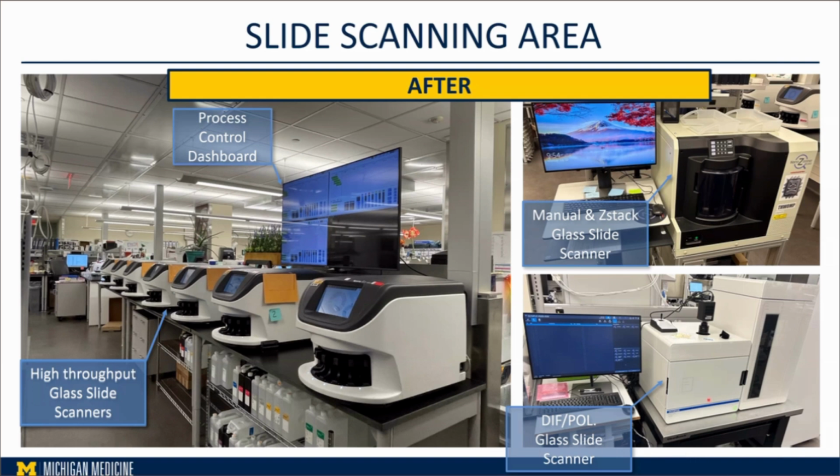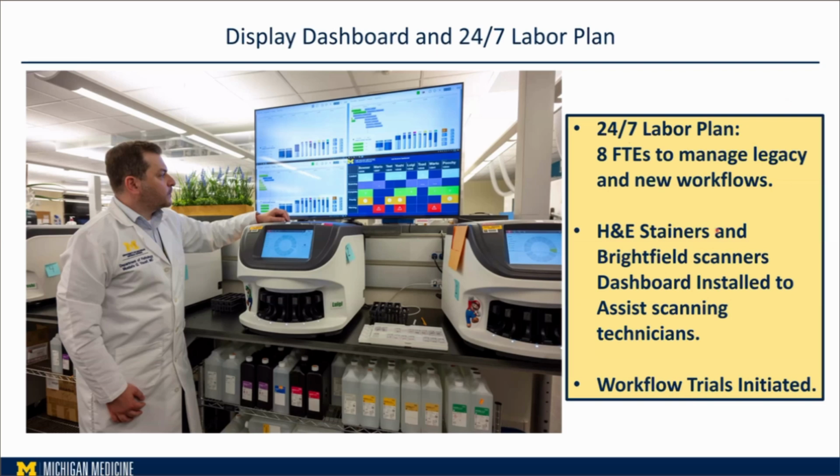We also, as I said, put into account a 24/7 labor plan, with multiple FTEs to manage it, and multiple dashboards to help us have an efficient workflow: when are those slides ready to be picked from the stainers and distributed, and which scanner right now is available to be loaded, for example.